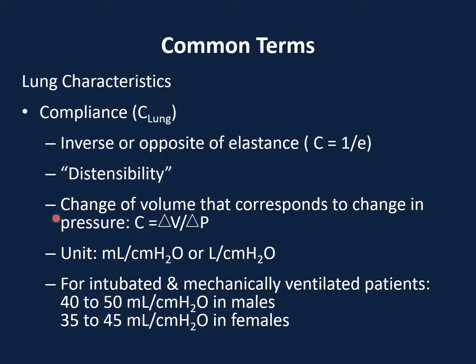And that can be expressed in words in terms of change of volume corresponding with the change of pressure, and this is the expression. Okay? And the units for that, based on the expression above, is milliliters per centimeters water or liters per centimeters water. Okay, so just again for your reference, this is the general lung compliance for some patients who are intubated and mechanically ventilated. This is considered normal.